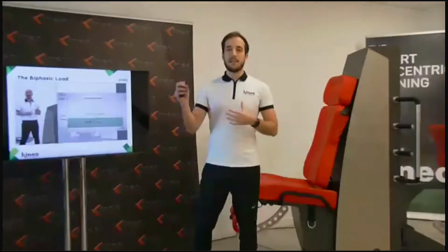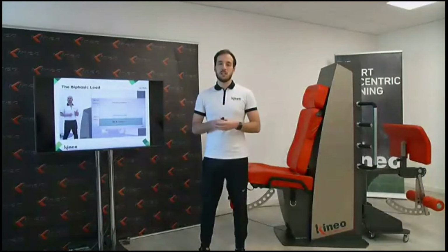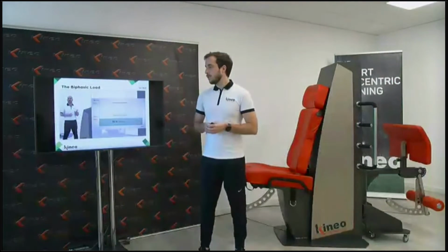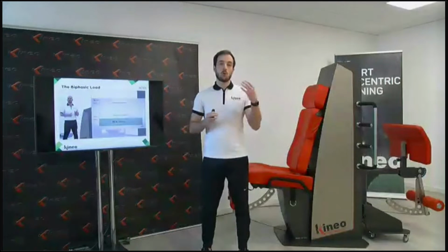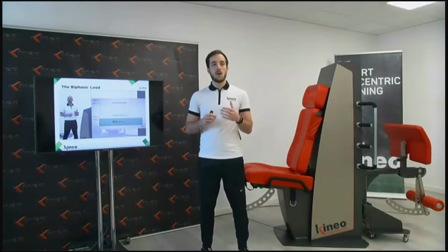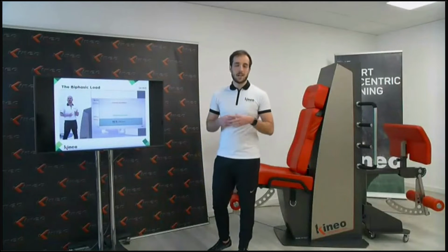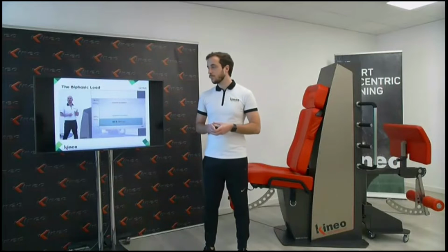All right, so a quick video, a lot of concepts with it. As I said, a test that measures concentric and eccentric, because we know how important evaluation is in our job to fix our goals at the end of the day. And as you saw in this video, we talk about concentric and eccentric with two different loads. So not the same kind of load like in traditional weightlifting, but different loads, of course, with the use of Kineo and the machine that you will see in this room.